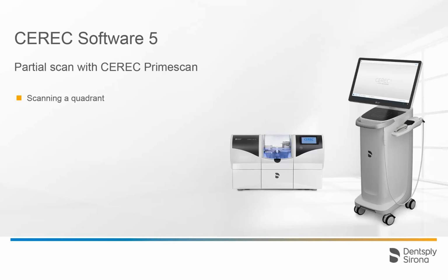Welcome to this video tutorial on the topic of partial scan with CEREC Primescan. With Primescan, scanning is easy and straightforward. Without any special scan strategy, very good results can be achieved. If you don't have a preferred scan workflow yet, this is a scan strategy for a partial scan that is easy to learn and works well.